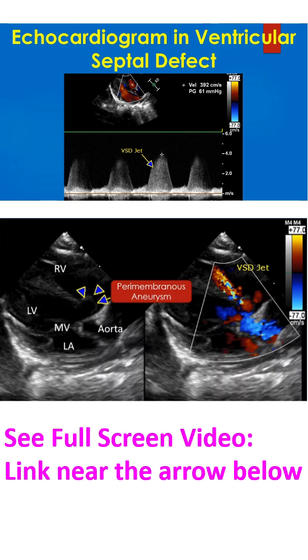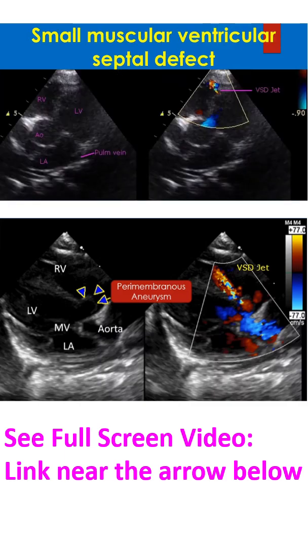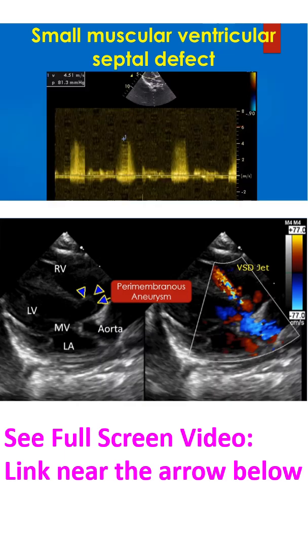Sometimes a right coronary cusp prolapse can cause aortic regurgitation even in a restrictive VSD. This echocardiogram in apical 5-chamber view shows the mosaic multicolored jet of a small ventricular septal defect near the apex. The cardiac chambers are not dilated. The small defect is difficult to see on 2D echo, though it is easily detected clinically with a pansystolic murmur, and Doppler echo documents the high velocity jet across the VSD. Continuous wave Doppler interrogation shows the interventricular pressure gradient as 81 mmHg, consistent with a restrictive VSD.